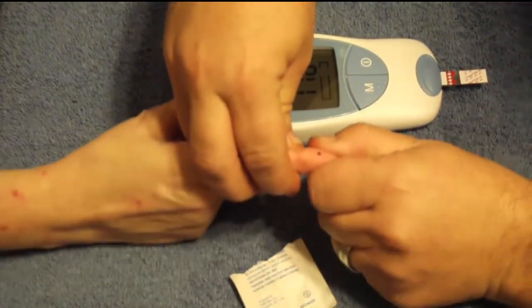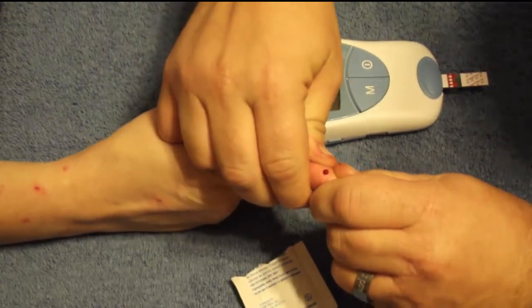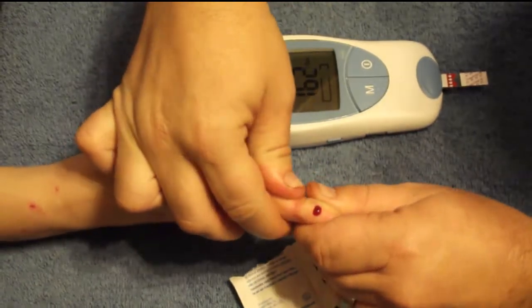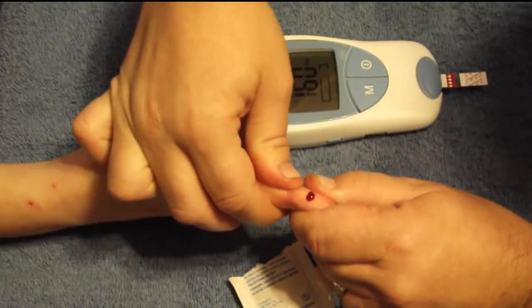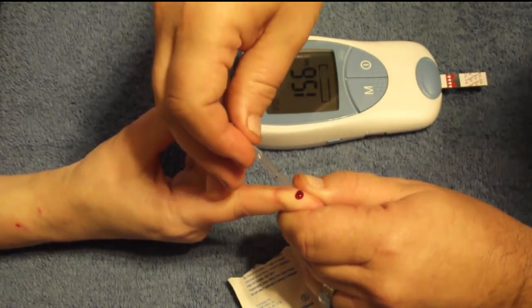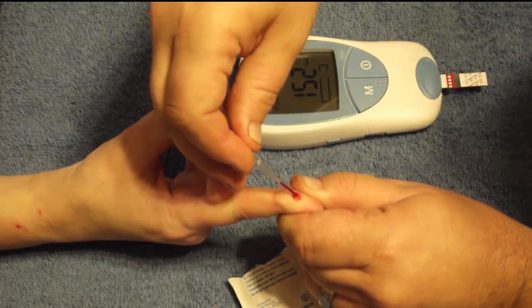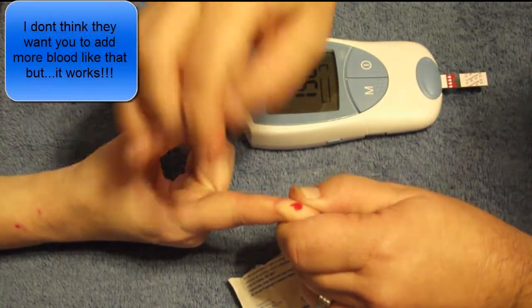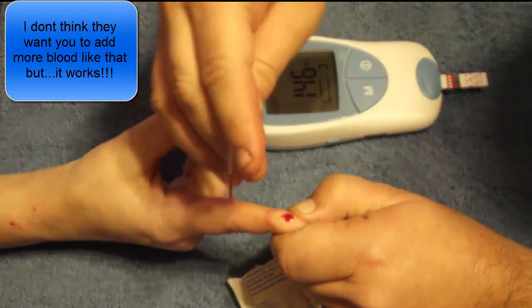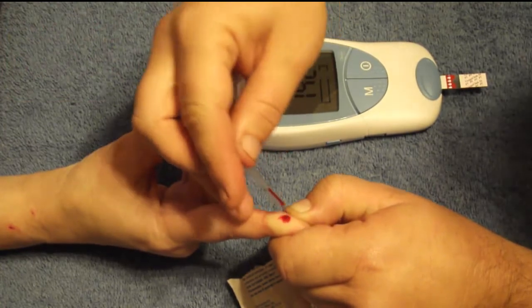Now, you need to get a fairly good-sized drop. When you get the machine and they set it up for testing, they tell you about a ladybug-sized drop. Hopefully that's enough. That's why the machine gives a countdown — you can only apply the blood until it counts down far enough.